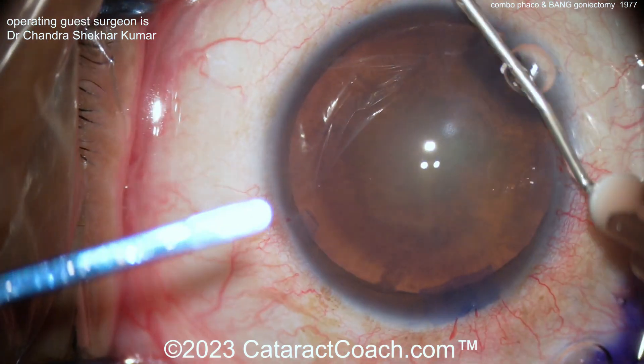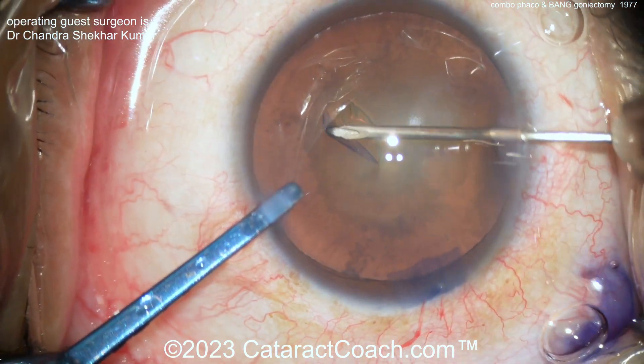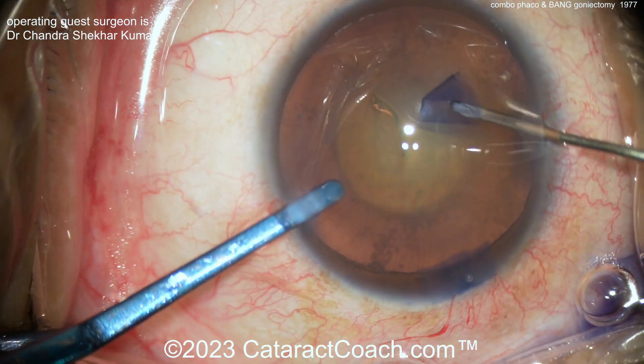You can see there's the cataract. The patient's going to have the cataract part first, and then once the IOL is in the eye and the AC is still full of viscoelastic, you can go ahead and do the BANG procedure.